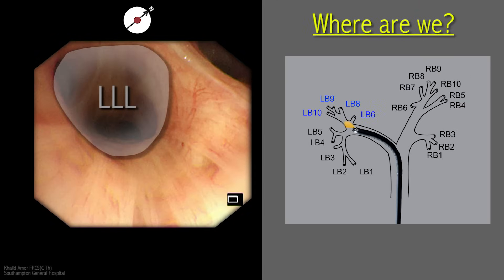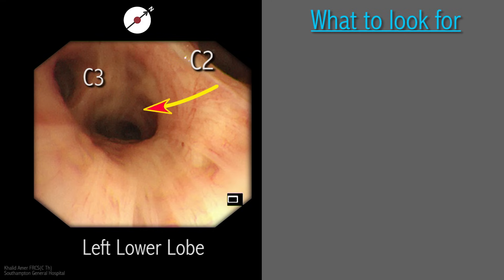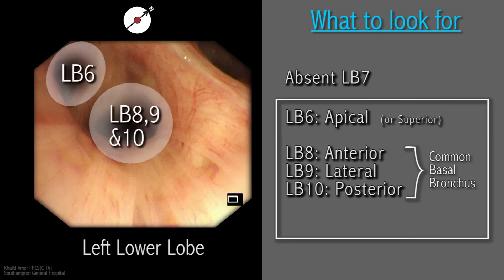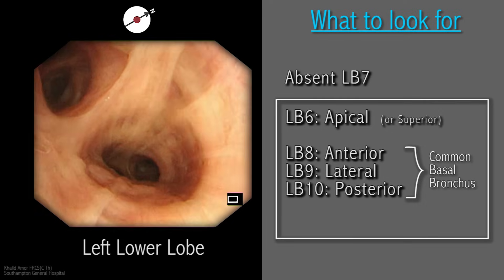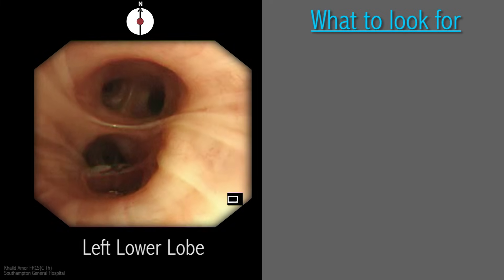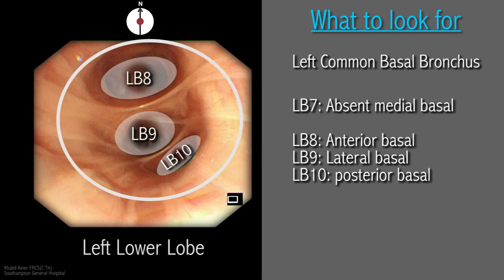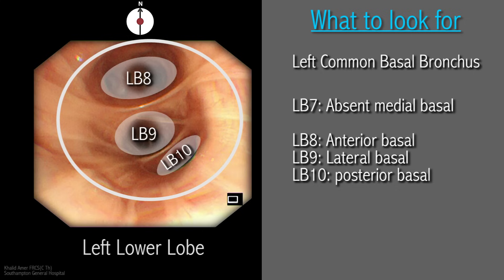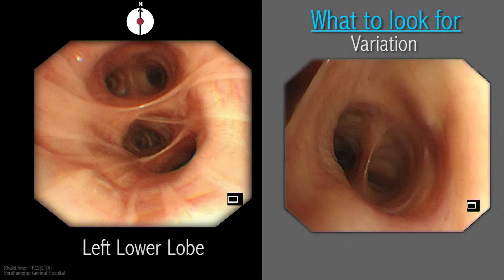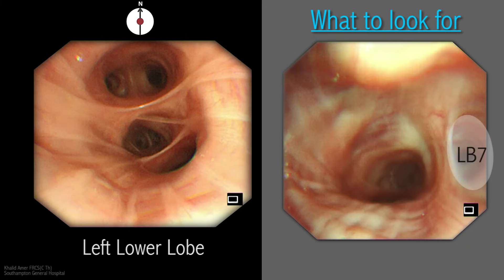The scope is then retracted before being introduced into the left lower lobe. Once more, note is made of the secondary and tertiary carinae to define the inlet and outlet of the lower lobe bronchus. Like the right side, the left lower lobe retains the structure of an apical segment and common basal parts. The apical segment is LB6 and usually divides into three subsegmental bronchi. The medial segment LB7 is squashed and is usually missing in the normal arrangement. Therefore one would expect to see three divisions: the anterior (LB8), lateral (LB9), and posterior (LB10). The commonest variation to the common basal segments is two divisions. Sometimes the medial basal LB7 persists.